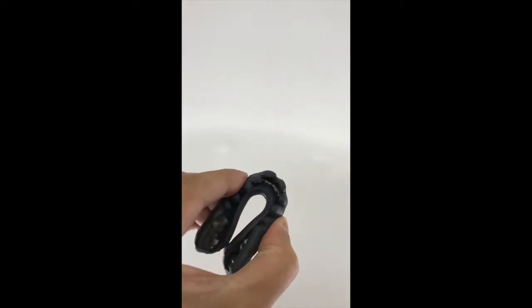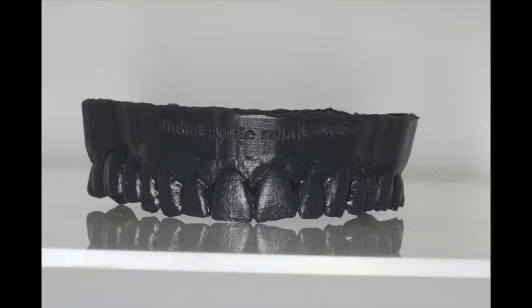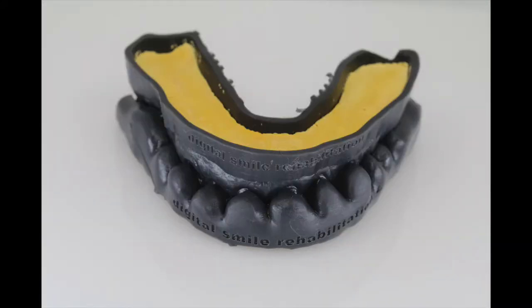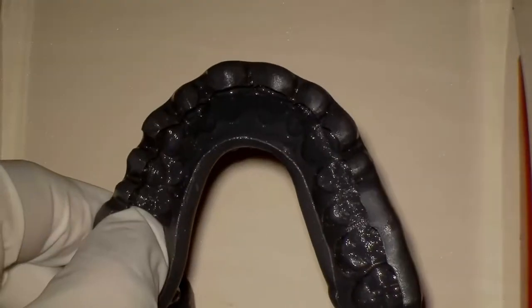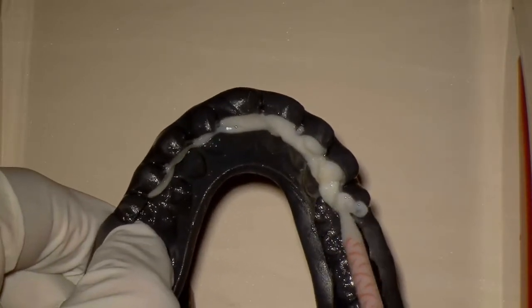The matrices are flexible, and you can have multiple matrices made to reflect different tooth shapes and be able to visualize in the patient's mouth what is most aesthetically acceptable. Normally, we just have one option. Now, when it's an additive wax-up, meaning you're making the teeth longer or bringing them out facially, this works well. You can use the matrix in the mouth, or using this technique, have them pre-made and just seat them in the mouth.